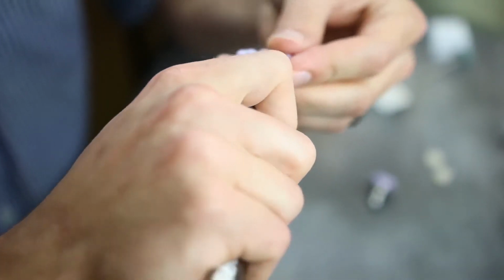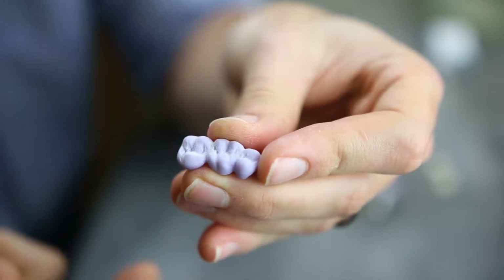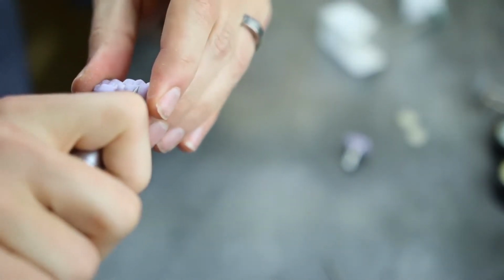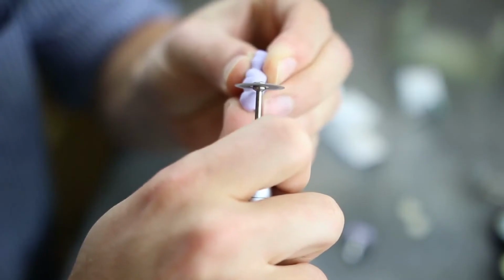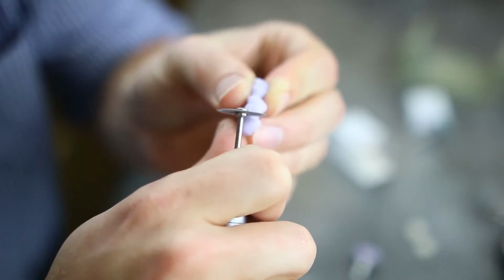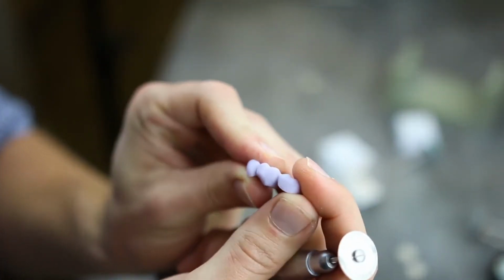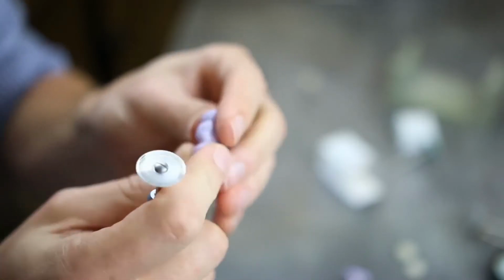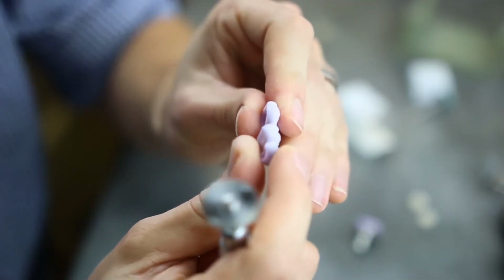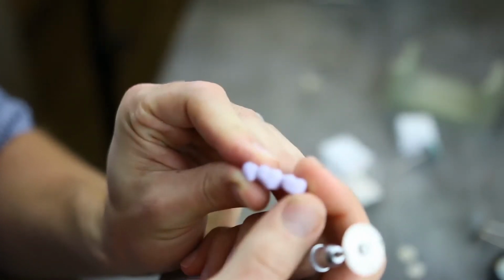And one thing we see when we look at our bridge restorations is that there's these very curvaceous interproximal areas, and that's not how teeth look. So we want to try and hide those as much as possible, and it's difficult to get even a flame-shaped diamond into those areas. So a better way to do it is to use the same sintered lab wheel with diamond around it, and to nurse it into the contact points between the teeth. This will accentuate the illusion of individual teeth while maintaining the integrity of the bridge. So we don't actually cut all the way through. It's just half a millimeter or so more depth accentuation into those areas, and it's a really effective way of aesthetically making the bridge look like you've got three completely individual separate teeth.